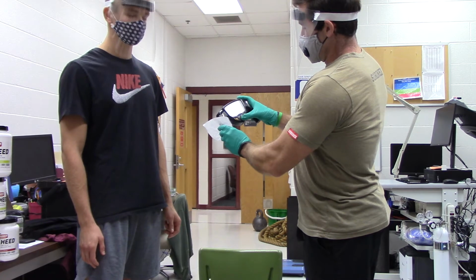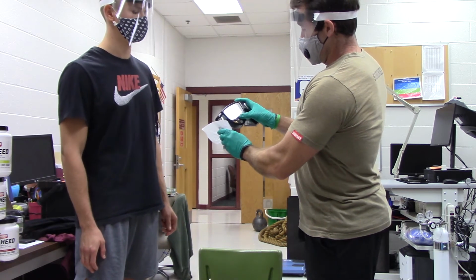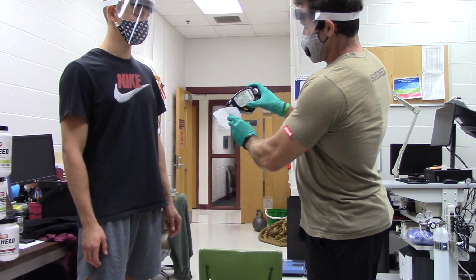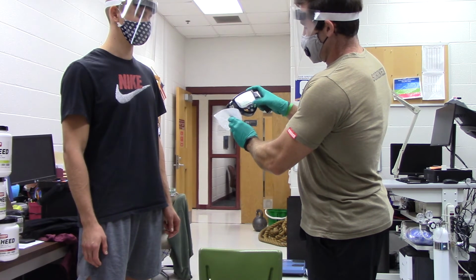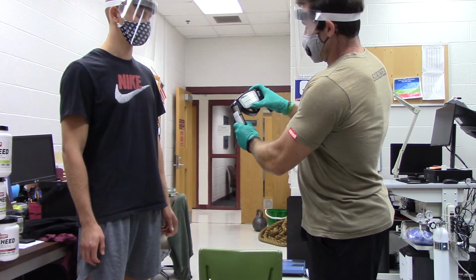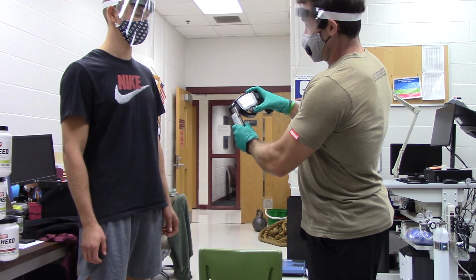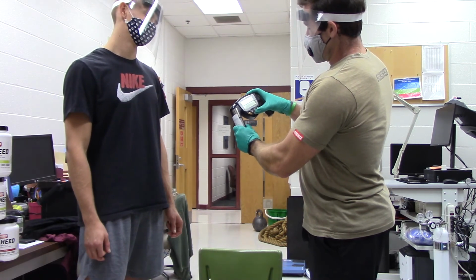Hit set. He has a body weight of 182 pounds. So we're going to go ahead and come on over here. Get up to 182. Hit set. His age is definitely not 40. We're going to go with 23. Right? 22. 22, man. Almost 23. Almost 23. And he is male for the gender.